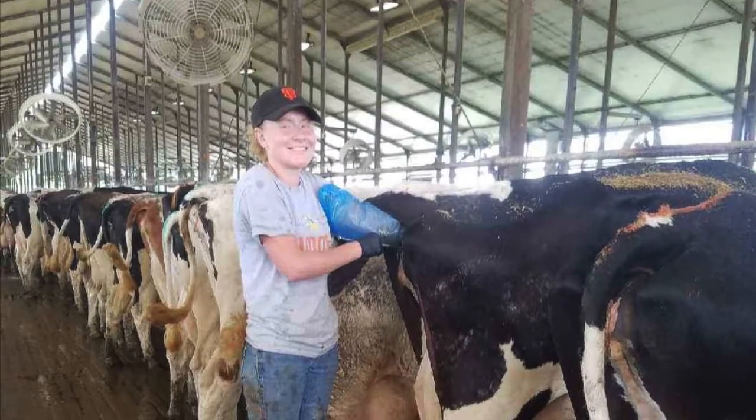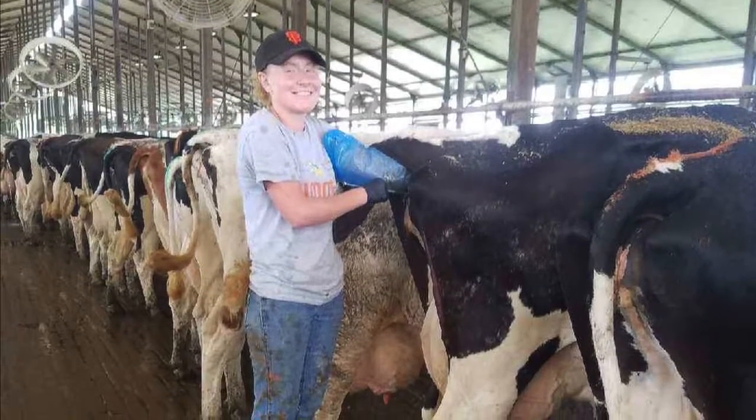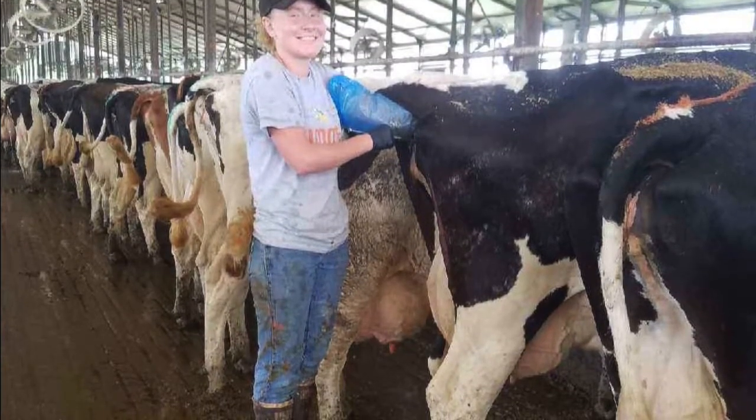You push the breeding rod through to the anterior vagina until it reaches the cervix, where you will feel it with your other hand. Now you can maneuver the cervix around the breeding rod and breed your cow.